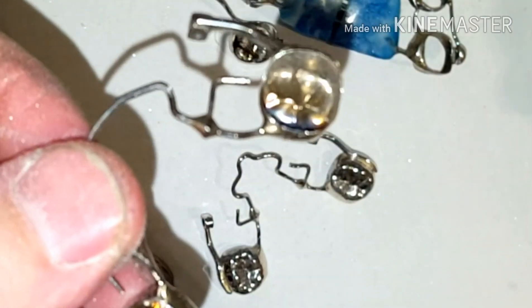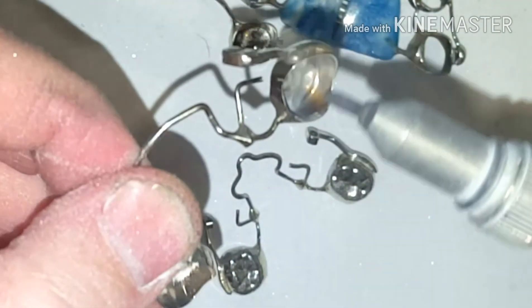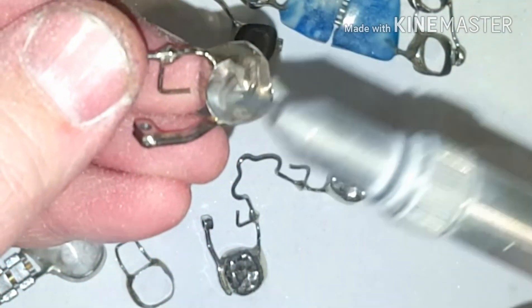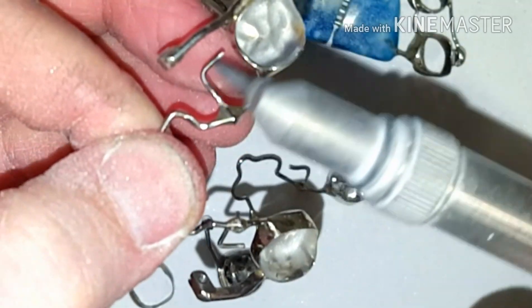You can see in this crown there's a burn mark where the solder joint was. I want to roughen that area up. I also do the rest, which helps the glue bond to the teeth better.